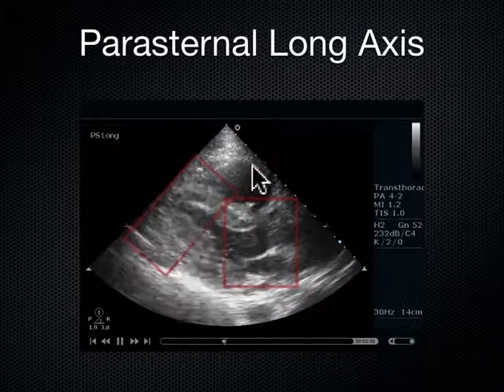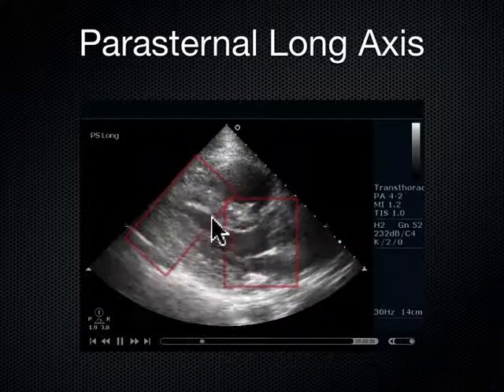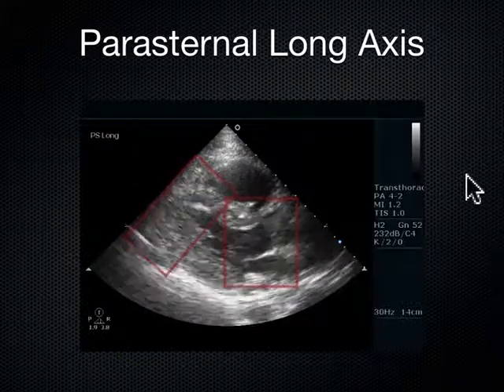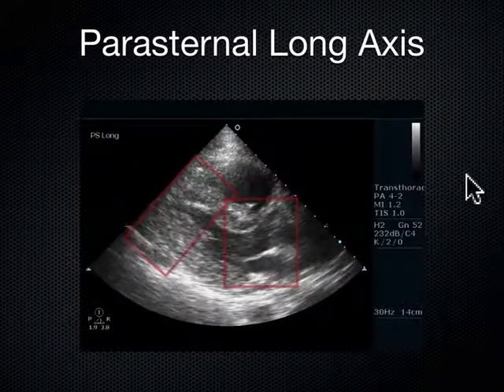Here's another thing I'm noticing. The right ventricle is up here. It's actually larger than the left ventricle, and in certain settings, this is a problem because when we see somebody with a large right ventricle, normally the right ventricle is only two-thirds the size of the left ventricle.